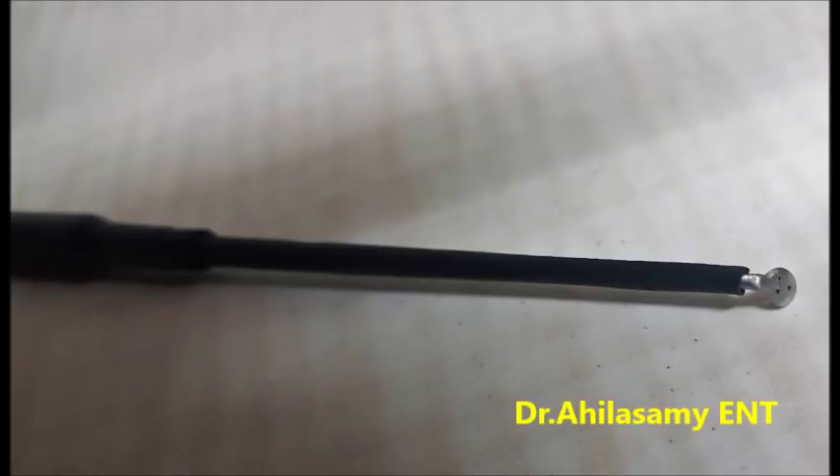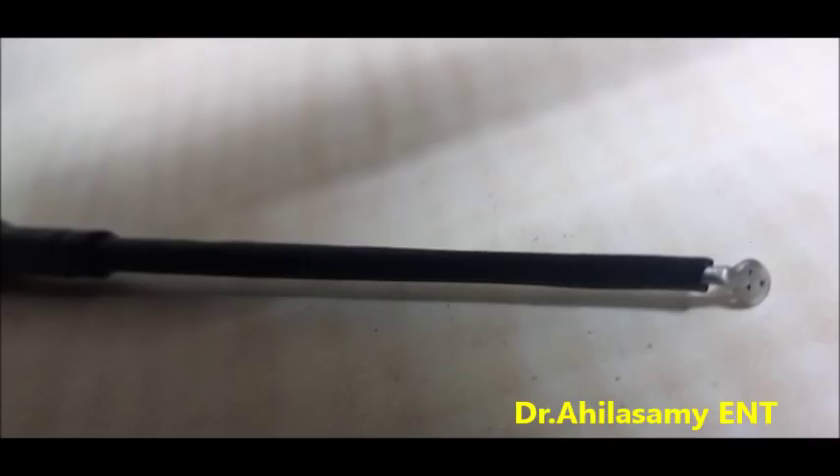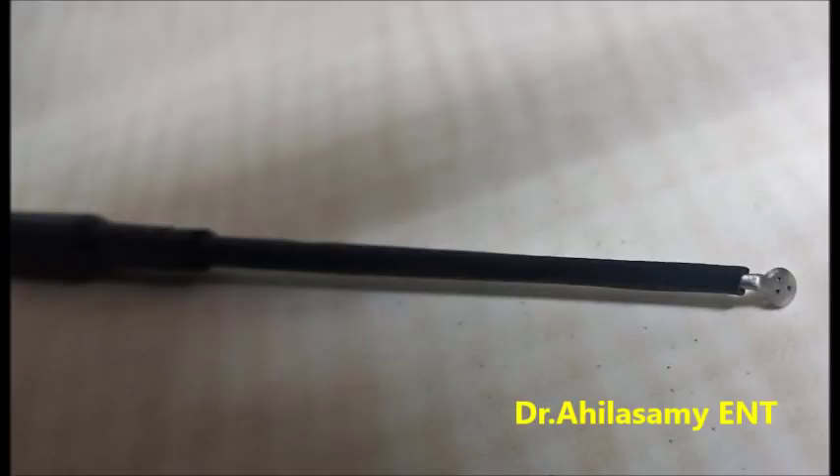People who struggle with single-handed endoscopy ear surgery, this is a great instrument. This is a round knife but insulated and attached to the cautery as a monopolar round knife. The biggest difficulty with endoscopy ear surgery with a single hand is the bleeding when you make the incision for the tympanomeatal flap.